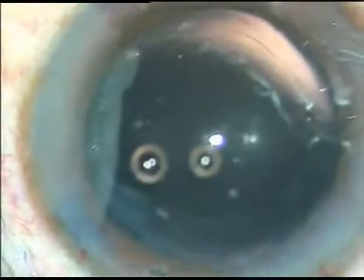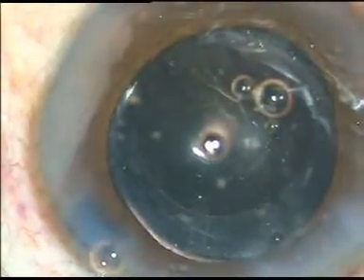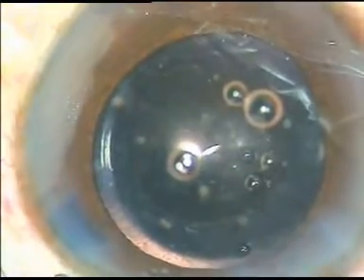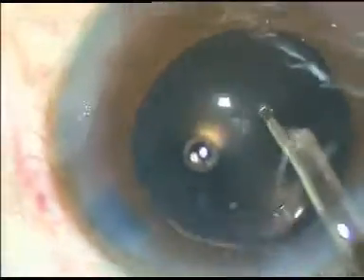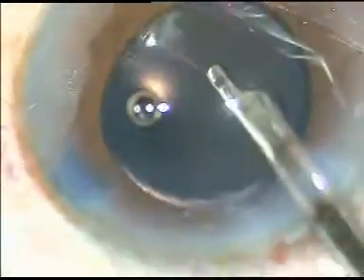Now this is the time for implantation of the IOL inside the eye. Here it goes. The leading haptic goes inside the capsular bag and the trailing haptic is also dialed into the capsular bag. Now it is time for aspiration of the viscoelastic substance from the anterior chamber. Direct Simcoe cannula is initially taken for preliminary wash out of the viscoelastic substance. A bit of polishing of the undersurface of the anterior capsular ring and some cortical fibers are probably there. It is being managed.